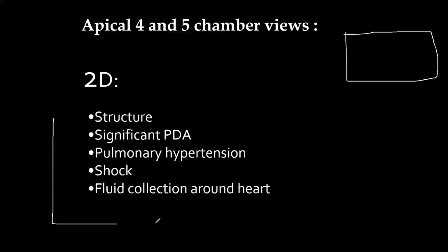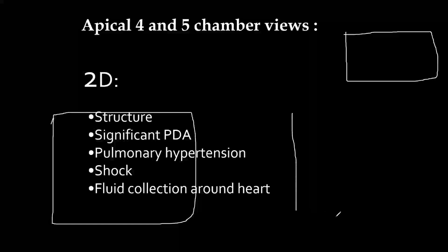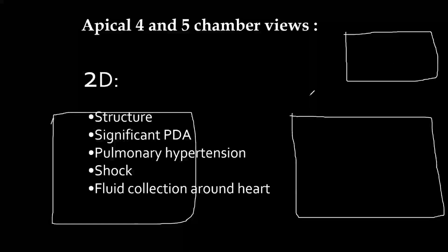Then you concentrate on this part of the slide, where you will see the video of the structures you will be seeing where you have kept the probe. And then there will be a fixed picture in which the various structures are labeled. So there are three parts of the slide. First, you concentrate on part 1, part 2, and then part 3.